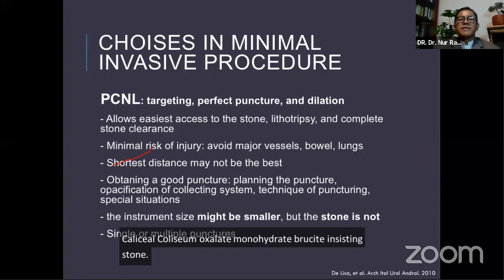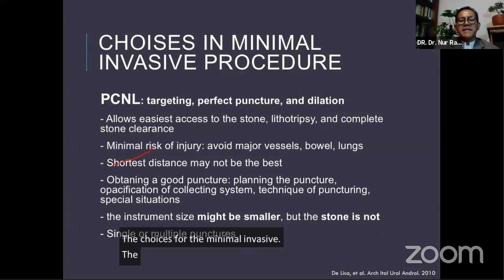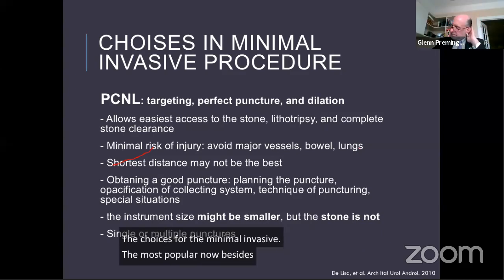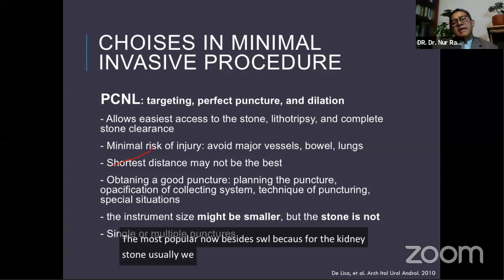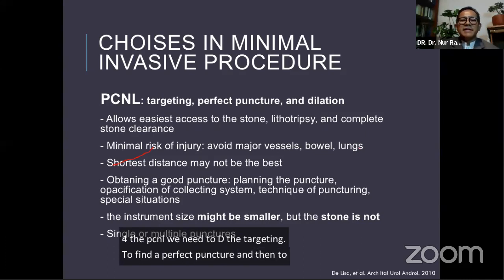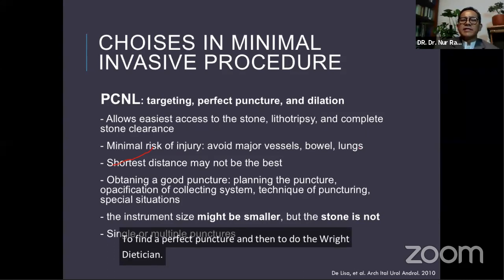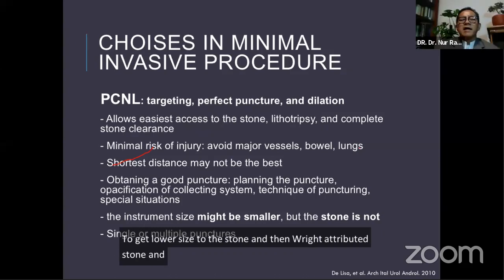The choices for minimal invasive treatment, the most popular now besides ESWL, because for kidney stones usually we do PCNL. For PCNL, we need to do the targeting to find the perfect puncture and then the right dilatation to get access to the stone, and then lithotrip the stone and make a complete stone-free rate with minimal risk of injury.